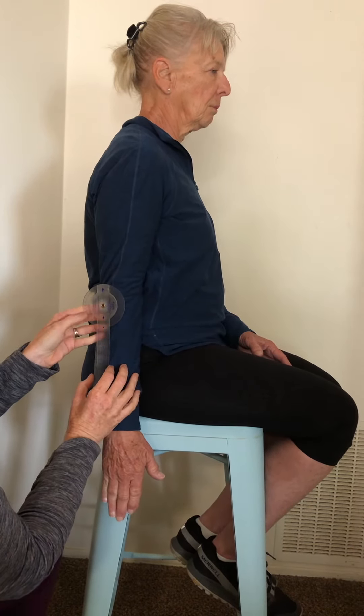Can you bring your elbow back? We're going to have her start at zero, and now bend your elbow all the way up. Following along the forearm, keeping in line, midline. She went from zero to 155 degrees of elbow flexion.